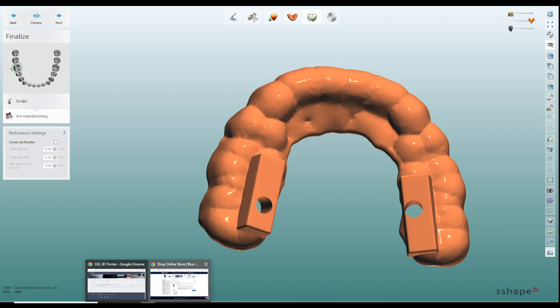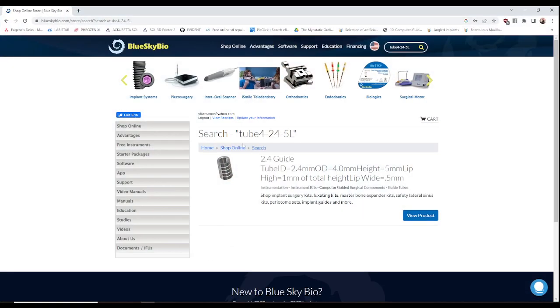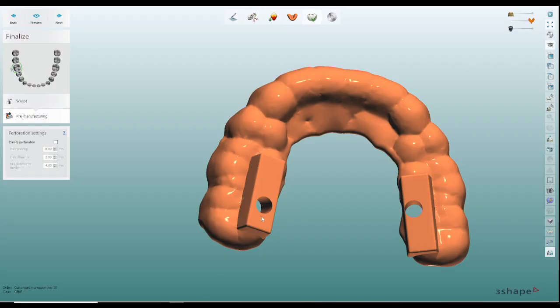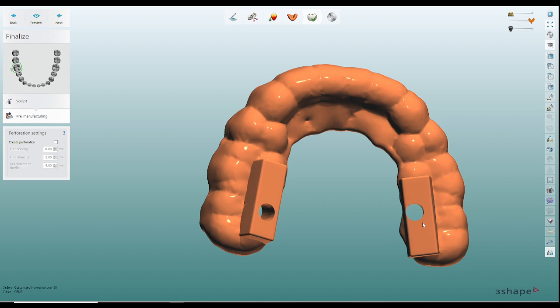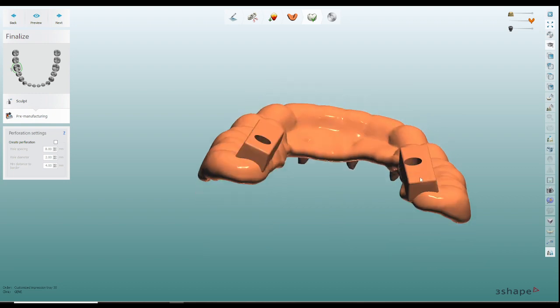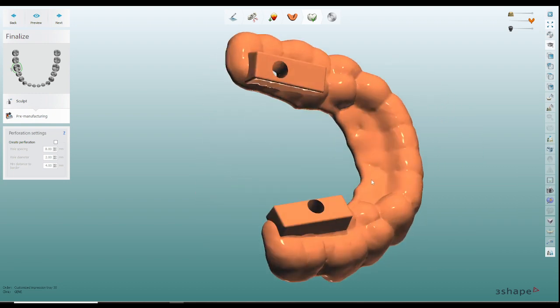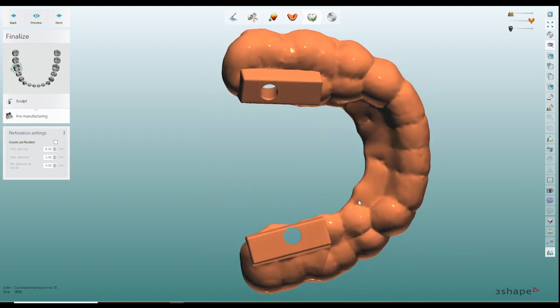The guide tubes that I'm actually using are these: if you go into Blue Sky Bio and you get a guide tube that has internal diameter of 2.4 millimeters and external diameter of four millimeters it should fit nicely into this area here. So 2.4 will allow number eight burr to slide freely in and out and because we've chosen four millimeter outer diameter you'll be able to place it in here.